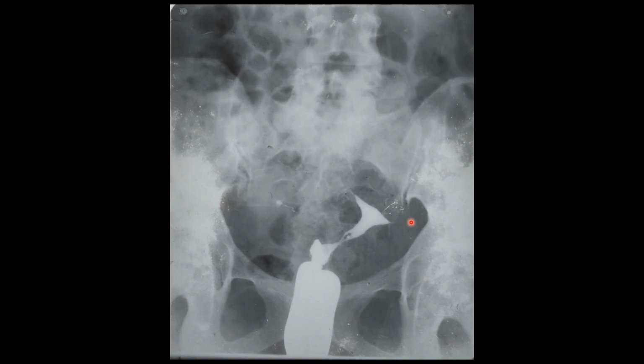So how do we do the procedure? We pass a suitable cannula, which at the same time obstructs the cervical canal. It is inserted into the cervical canal of the uterus. Approximately 6 ml of the opaque medium is injected and the X-ray film is obtained. If you see peritoneal spillage, that shows the patency of the uterine tubes.